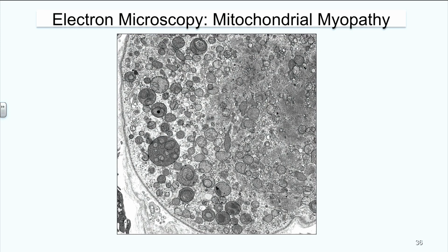Electron microscopy is the way to prove that the mitochondria are abnormal. Basically, what we do is take the same muscle that originally has been processed for fresh frozen tissue and histochemistry. It has also been stored in resin, and that one is subjected to electron microscopy, blown up many, many times, 10 to 20,000 times, and we can see actual mitochondria in this one myofiber.